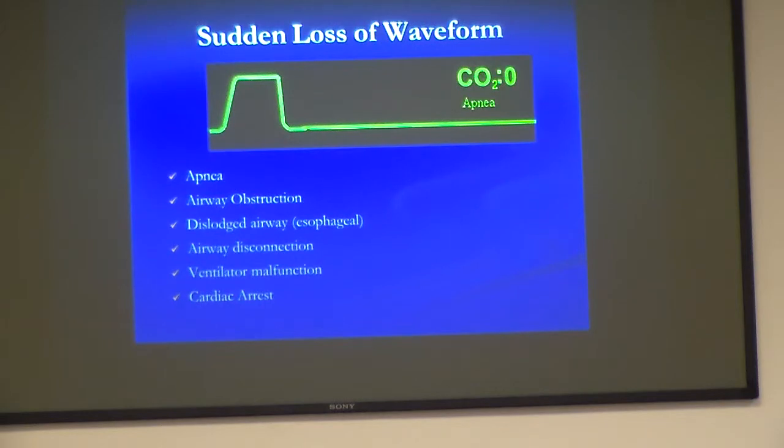So I took him off our ventilator and started bagging the patient, and immediately we got an end-tidal in the 20s, and it just went up to 35. And this is all obviously within 30, 45 seconds. But what was happening was I had a malfunction of my ventilator. It was not working, because I looked and I had no chest rise and the ventilator wasn't doing its job. But the pulse oximetry still read 98% the whole time we were doing this. So it just shows it.